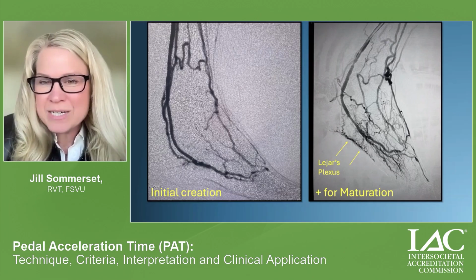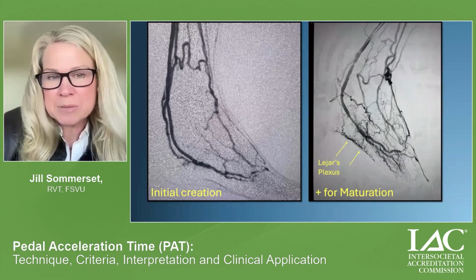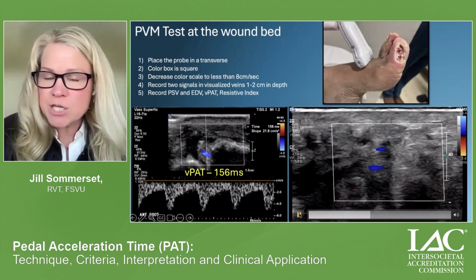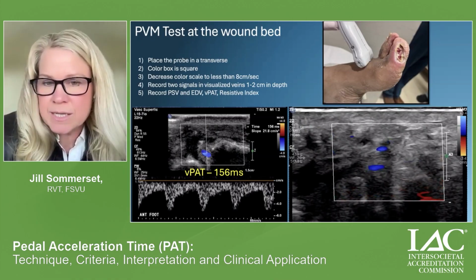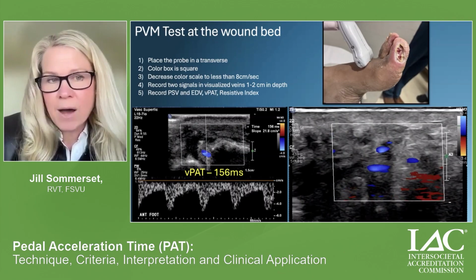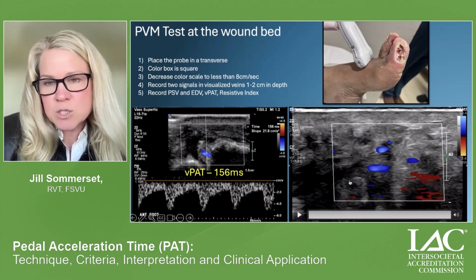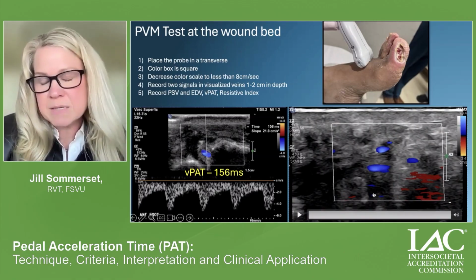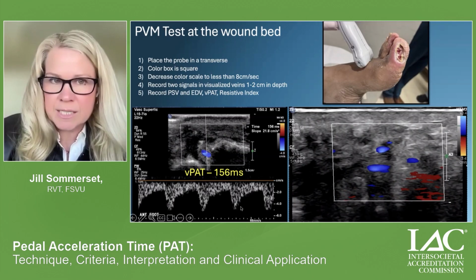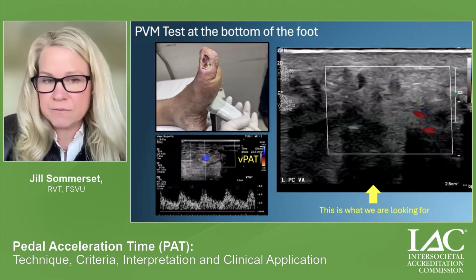But we can't do an angiogram on every single patient for their post-op duplex follow-up. So we are going to evaluate those neovascular beds with duplex ultrasound. And when we see this new arterialized flow in the foot, we can now measure the venous pedal acceleration time. So this would be positive for pedal venous maturation with a measurable venous pedal acceleration time. We do this test at the wound bed and at the bottom of the foot.